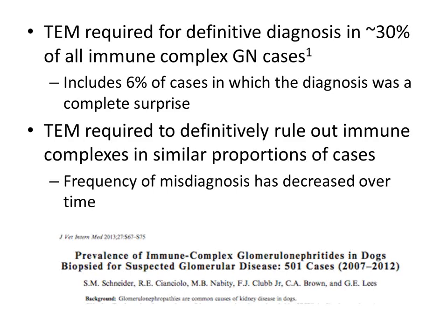And I think it was because it's probably a little bit of podocyte cytoplasm, and it wasn't regularly spaced nodules on the abluminal surface. So I think that even a novice who is excited can overcall things, and so that's why TEM actually helps you back off. If you know you're going to have TEM anyway, you're going to be more likely to say, let's wait for TEM.